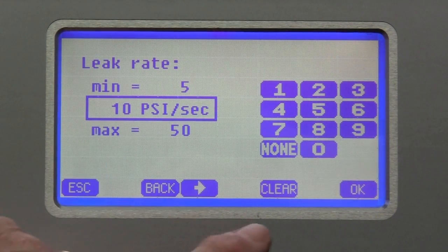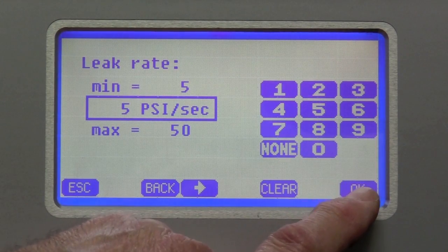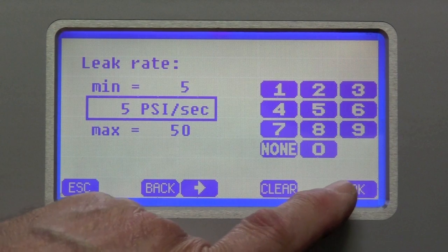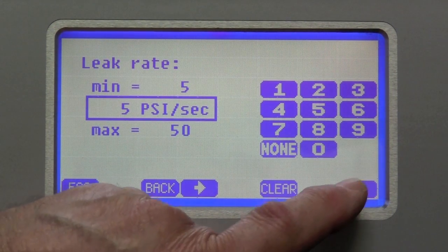We can set the leak rate here and we'll set it to 5 PSI. And that's 5 PSI per second. So at some point, if the pressure drops at a rate of 5 PSI per second, it will detect the leak.